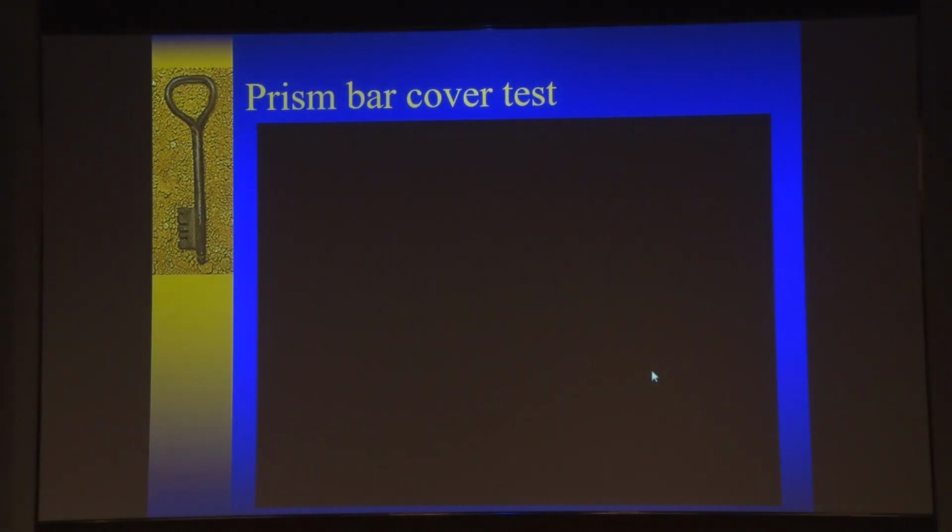I'm just going to take a second to talk to you about redress. Redress means you've got an exo, you expect the eye to come from out to in, but it not only comes to center, it goes slightly in and comes out. That's a redress. And that usually occurs when you're very close to the neutralization point. And then you get confused. Have I reached neutralization or have I overdone it?